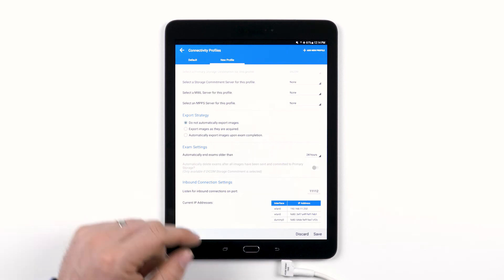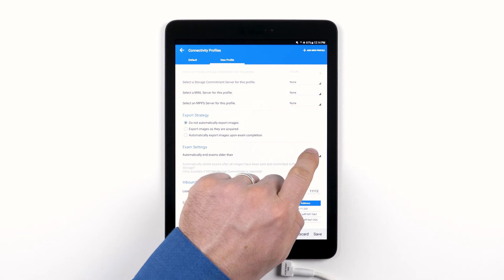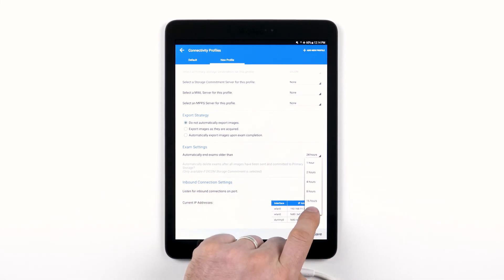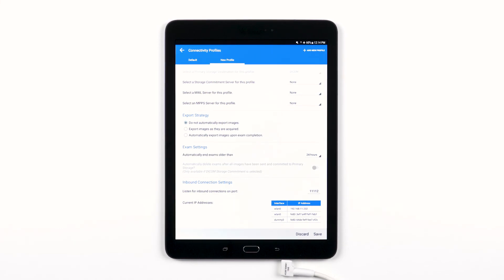The exam settings section just below allows you to set the amount of time you want to pass before the system automatically ends an open exam. For instance, if you haven't actively tapped the End Exam option, the Lumify system will automatically end the exam after the amount of time shown.